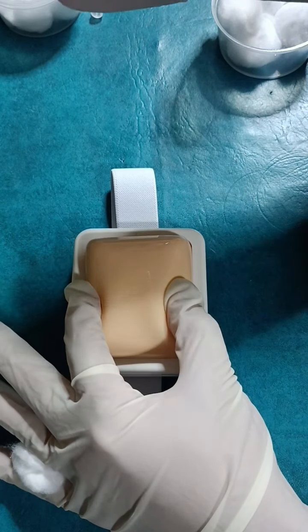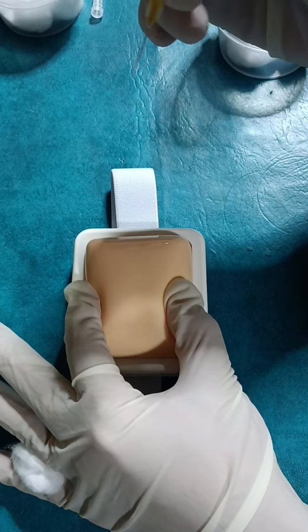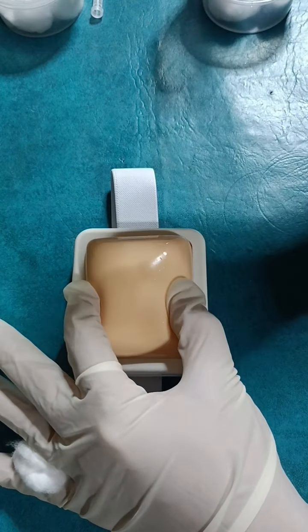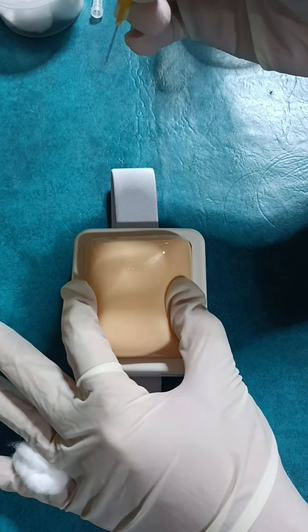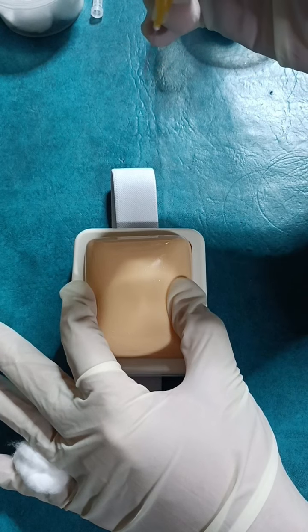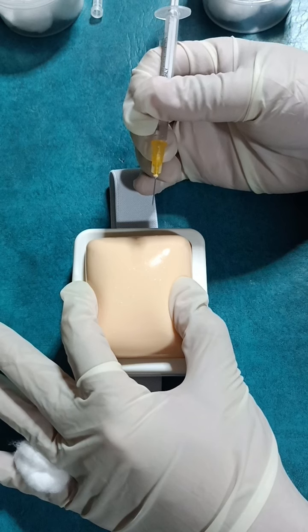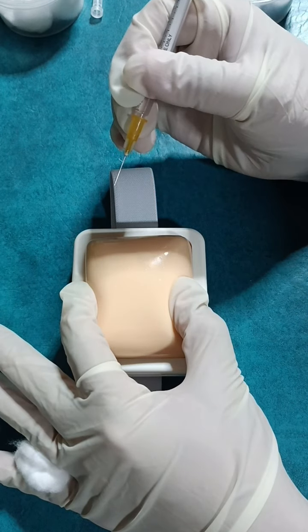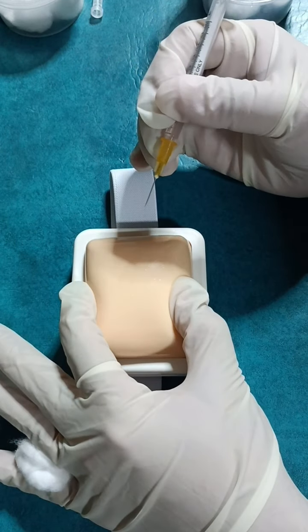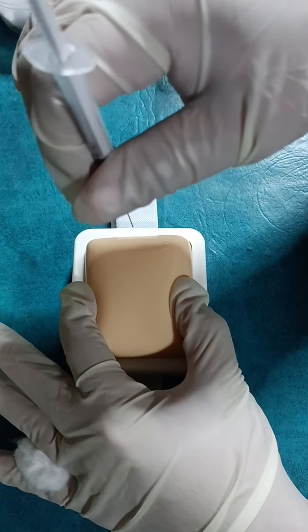Recommendations vary about whether to pinch or spread the skin and at what angle to administer subcutaneous injections. The most important consideration is the depth of subcutaneous tissue in the area to be injected. If the client has more than 1/2 inch of adipose tissue in the injection site, it would be safe to administer the injection at a 90-degree angle with the skin spread.